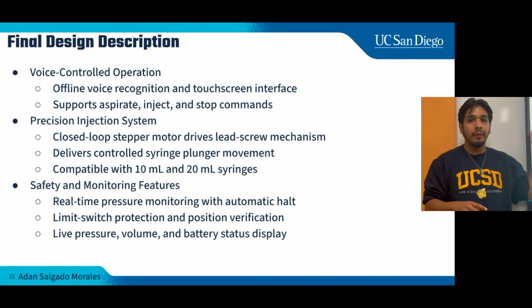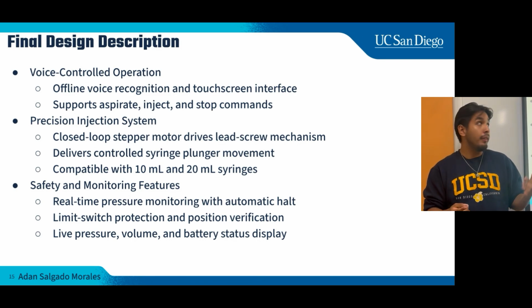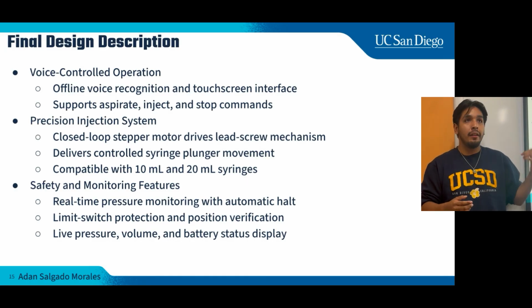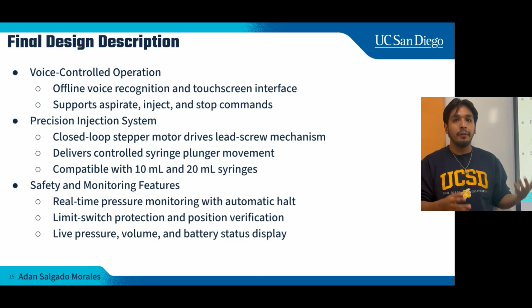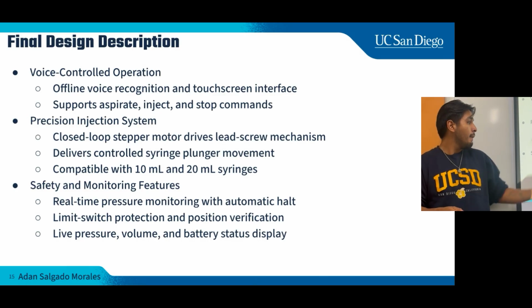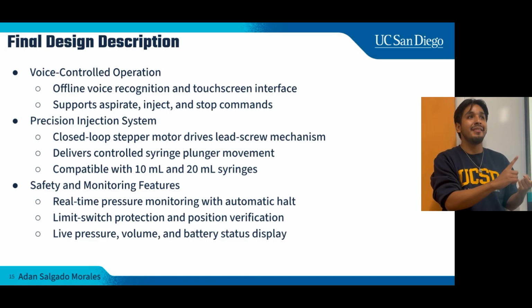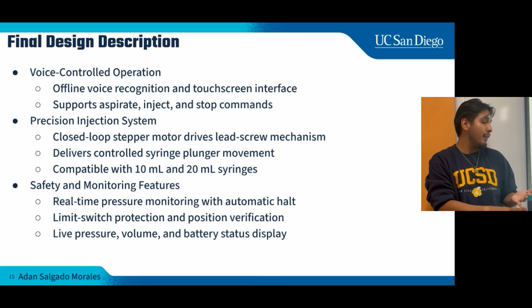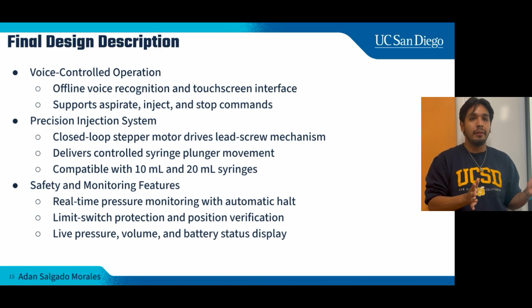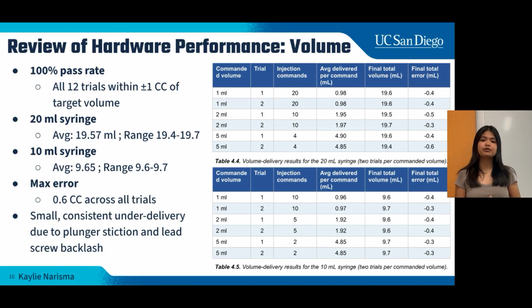For the voice operation system, we thought it was best to integrate it onto the touchscreen itself, and it is able to support the commands that we need, such as aspirate, inject, and stop. For the precision injection system, we have a stepper motor along with a lead screw mechanism that is able to deliver controlled syringe plunger movement that is compatible with both the 10 and 20 milliliter syringes. And lastly, we have the safety monitoring features, which is able to do live tracking of the pressure, the volume injection, and the battery status. We also have limit switches on each end so that we can prevent any damage to the carriage.